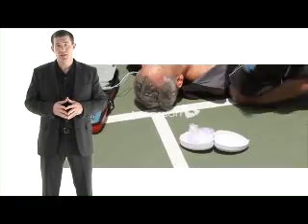We've already learned why the AED is important and what it does. Now it's time to learn how to use it, then practice the steps with a trainer unit. Remember the basic steps for AED use? Turn on the AED, follow AED prompts, resume chest compressions immediately after the shock or if no shock advised. If you can remember that, then you're almost ready to use the AED.